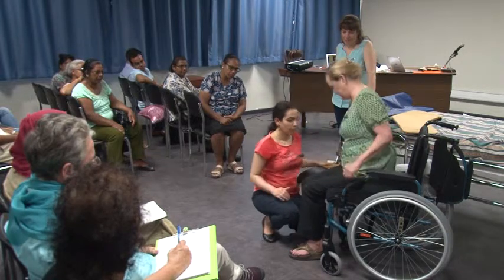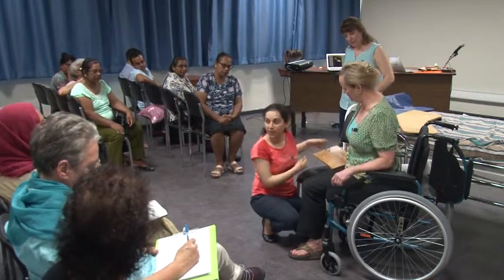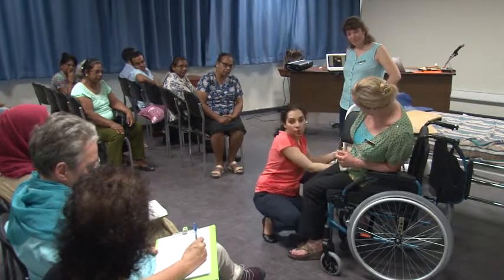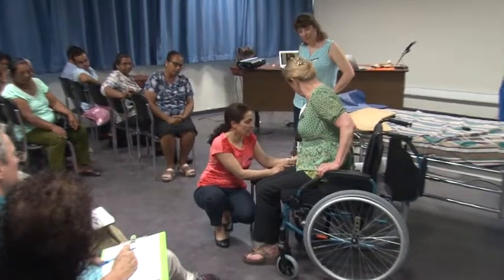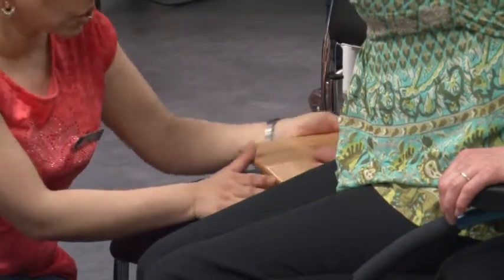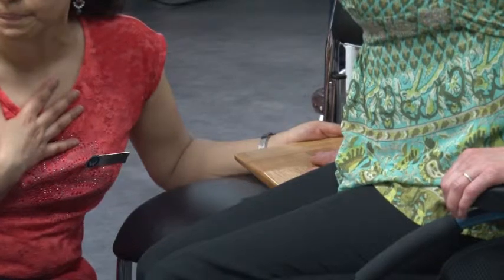Okay? Right? So this is very important, because accidents happen when the slide boards are not coupling. They're just coming with the person, right? Equipment is an important part of the transfer. Wherever you place the transfer board, the bottom is going to land there. So if your transfer board is facing here, the bottom is going to land here. And where do we want the bottom to land? Right on the chair. So that is where it should be placed, guiding it there. Okay? That's my half of the job done, just placing the equipment and myself properly, right?